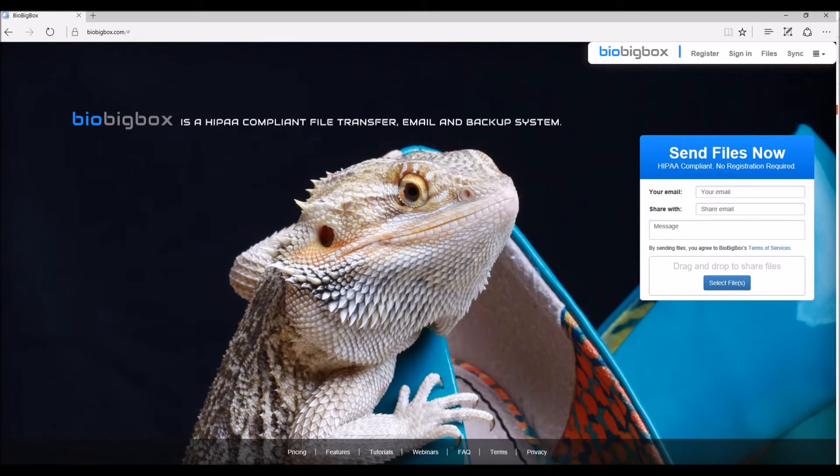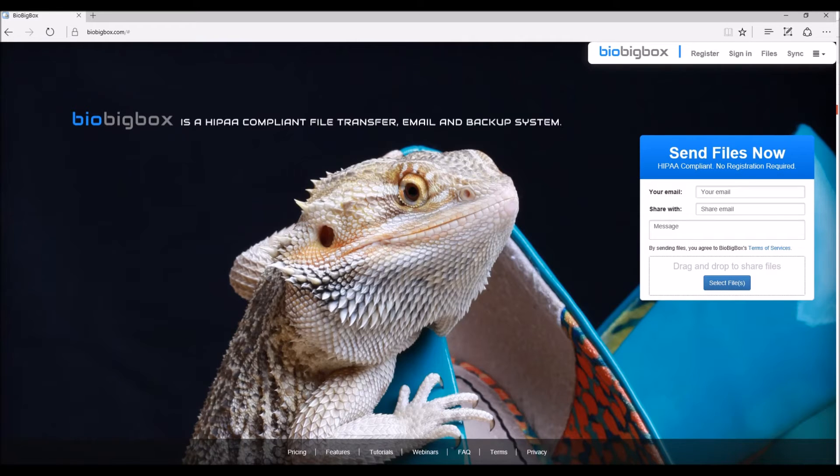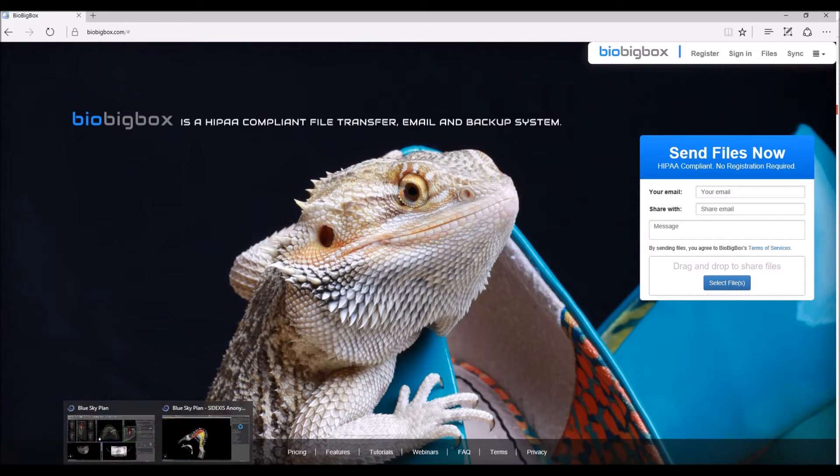BioBigBox has tons of great features and functionality, but we're not going to get into that right now. What we are going to focus on is the integration between BioBigBox and the Blue Sky plan software.